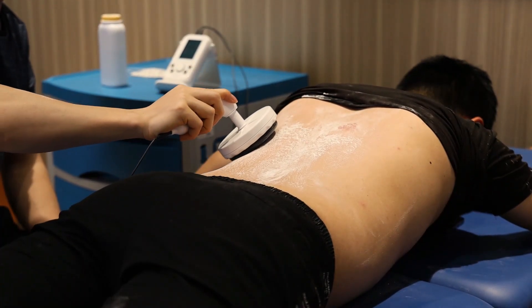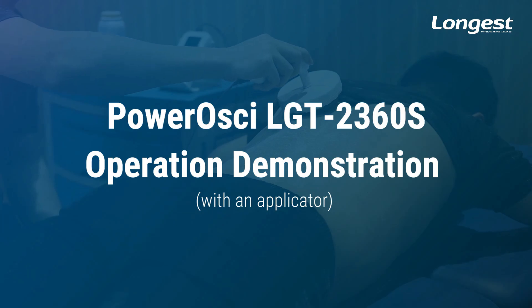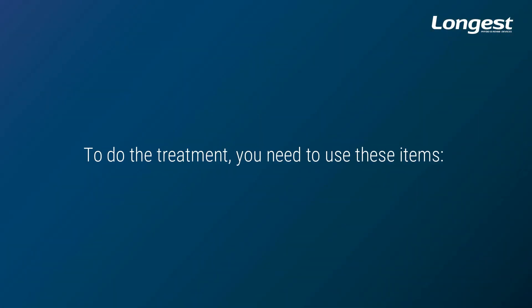In this video, we are going to show you how to use the PowerOsci LGT2360S with an applicator to treat patients step by step. For the treatment, you need to use these items.